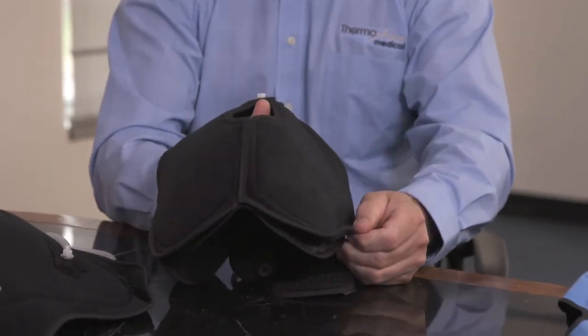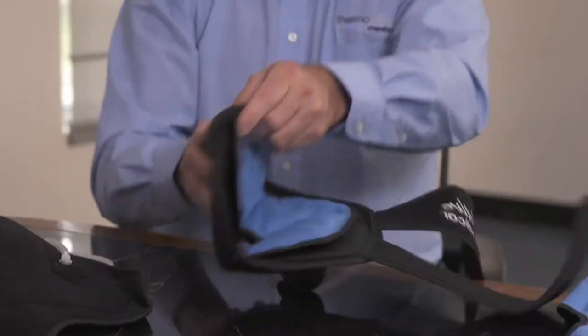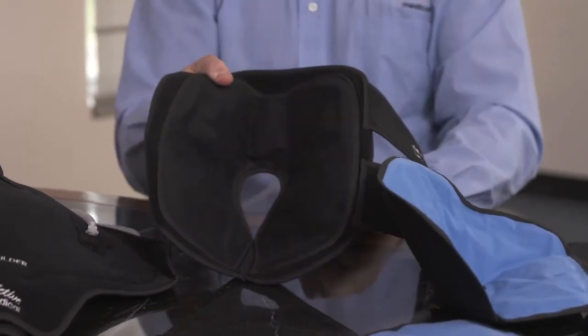Thermoactive Medical is a complete line of orthopedic braces designed to maximize patient outcomes for orthopedic surgeons and medical professionals. The fabric is an antimicrobial fabric which is very hook compatible and very durable. Also included in the outer support is our compressor.